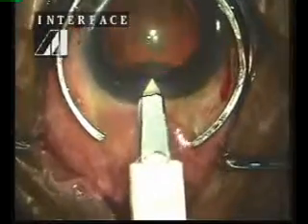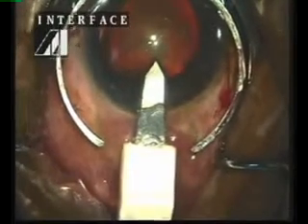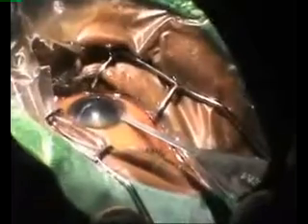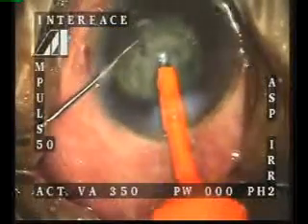Tapered width at the rear end of the blade creates a 1.9 or 2 mm outer incision lip to maneuver the microphaco tip and the infusion silicone sleeve without any kinking. Clear corneal incisions are made and when measured instantly indicate the active incision size. And when the phaco needle tip instrument with its infusion silicone sleeve is maneuvered in the anterior chamber, the effective internal lip size of the incision is altered to a certain extent on either side walls to approximately 0.1 mm.